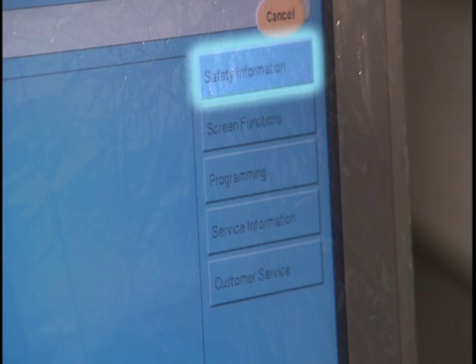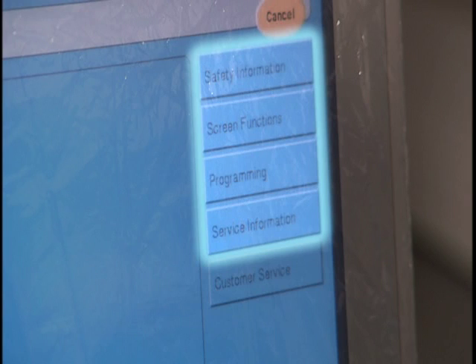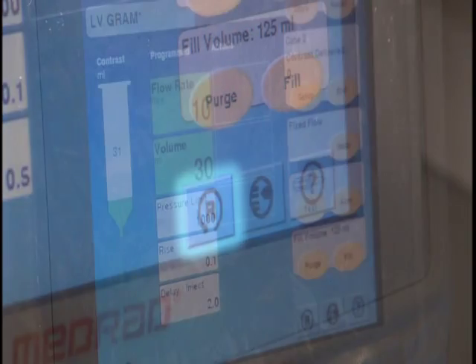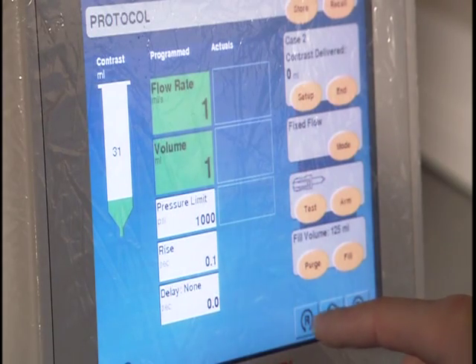Help includes the safety information, screen functions, programming, service information, and customer service. Reset is used to return programmed parameters to factory default settings.